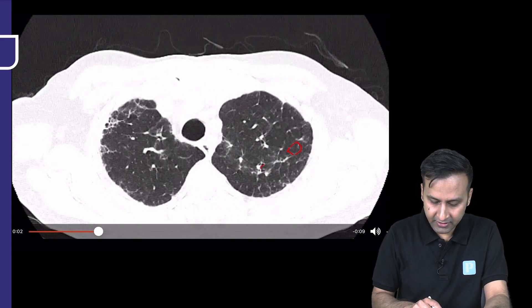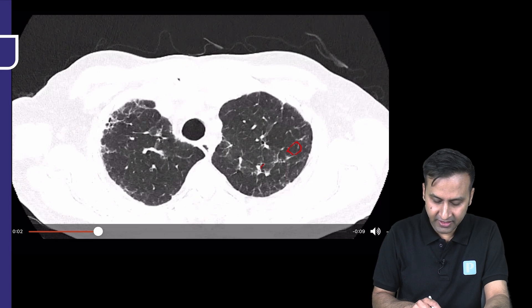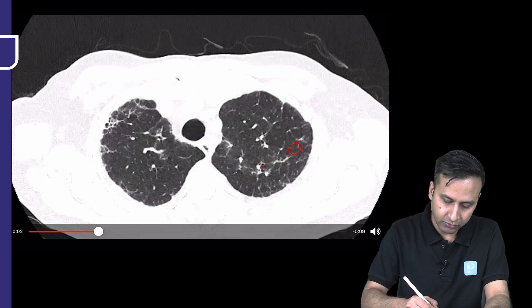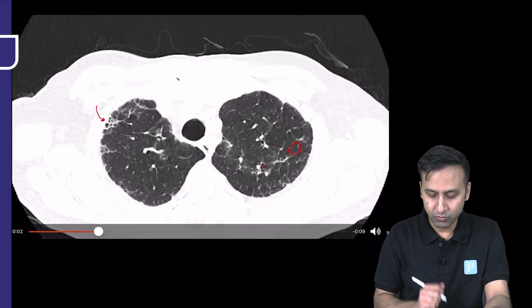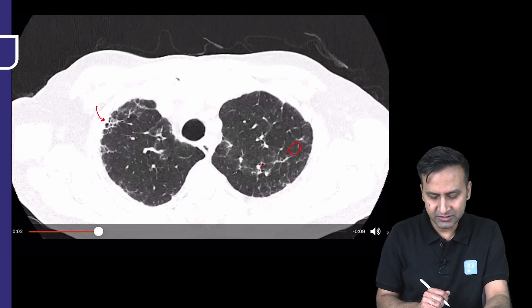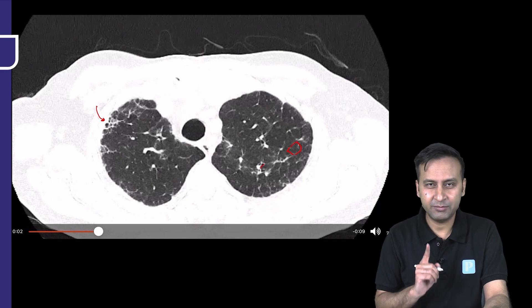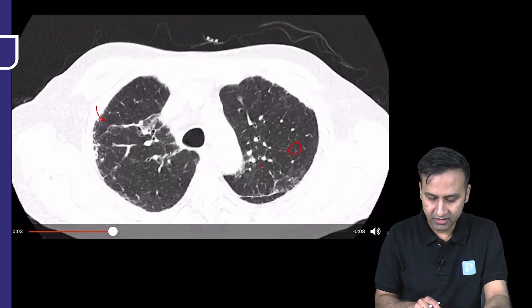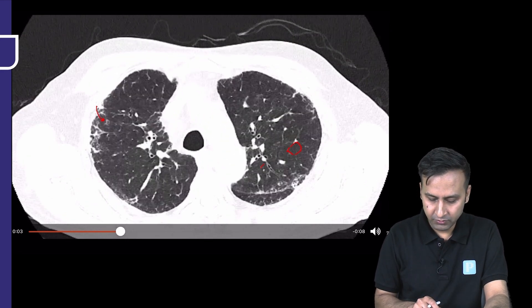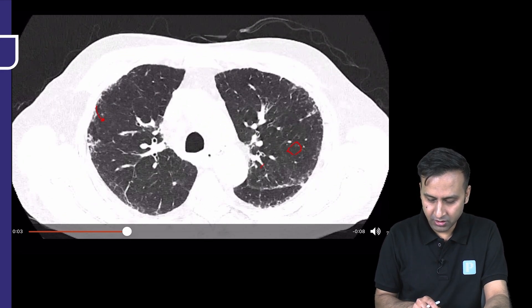Here we see that there is some amount of basal fibrosis resulting in a honeycombing type of appearance, but looking at one image it is difficult to say for certain. Let us go ahead and move down.